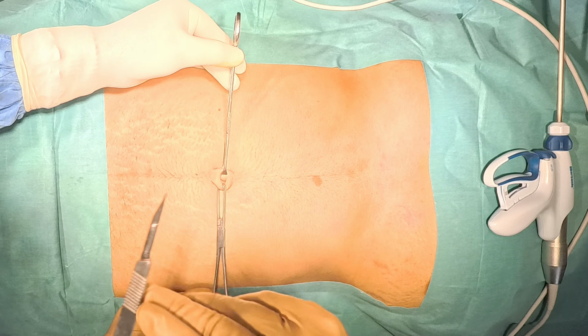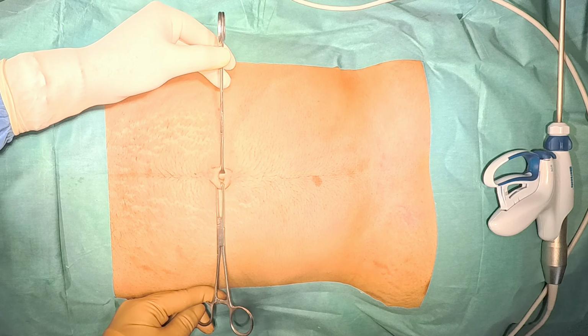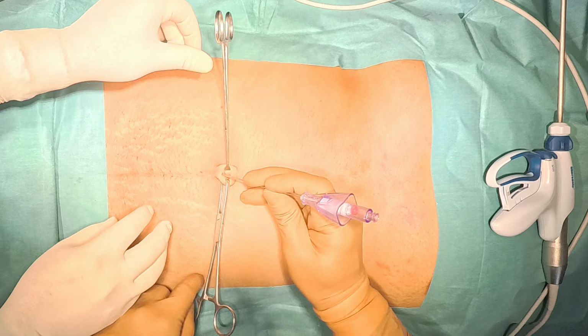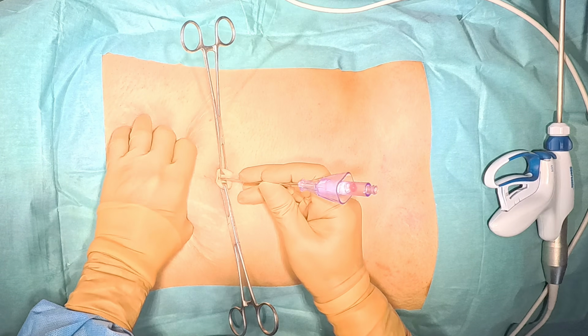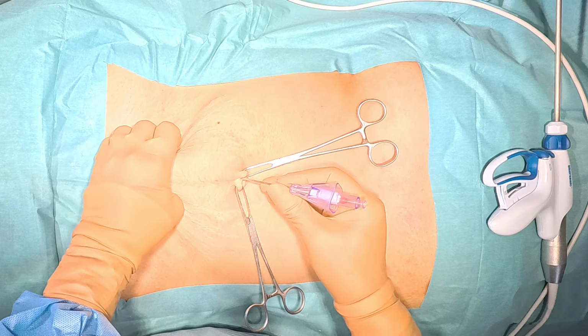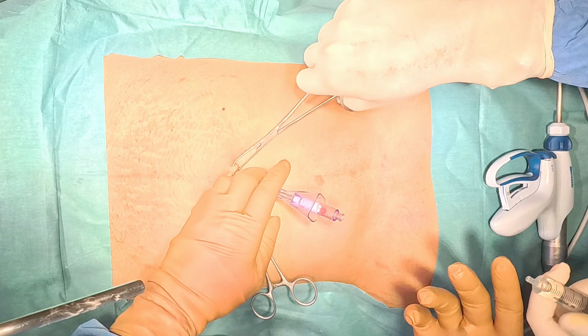So, we are stabbing the inferior crease of the umbilicus and then we will introduce the Veress needle over the inferior crease. We have to lift the abdominal wall in such a way that the Veress needle is perpendicular to the abdominal wall but oblique to the body.